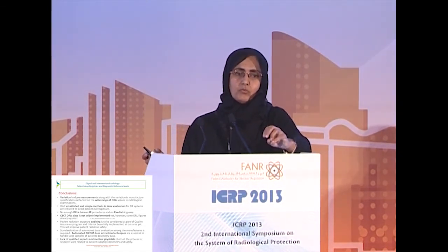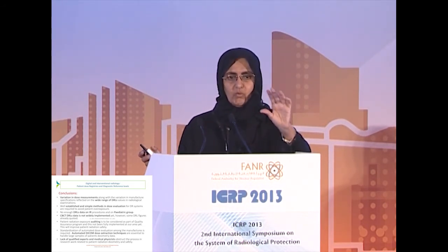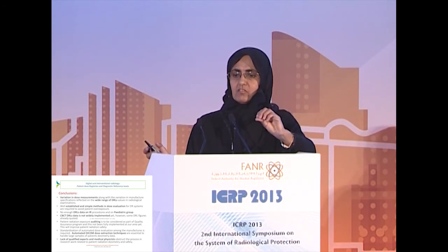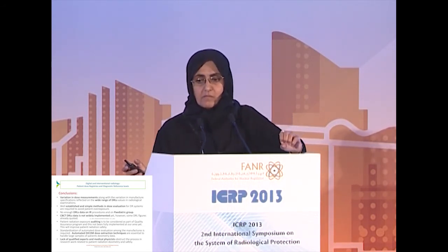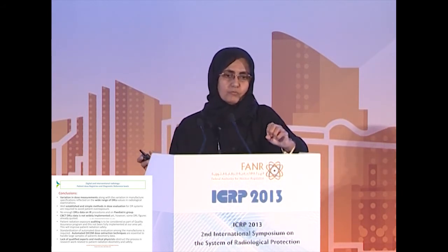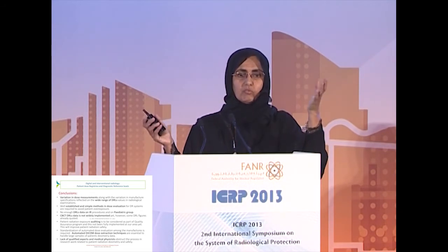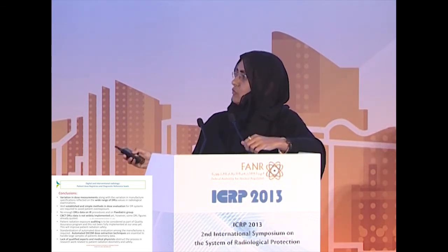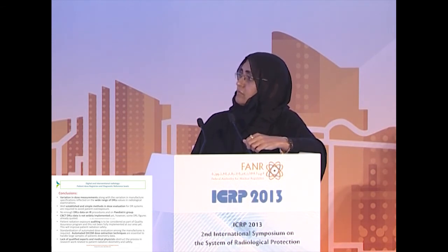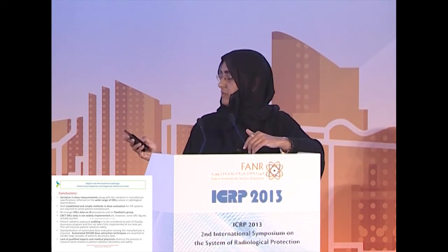Auditing is very important for us to implement. We have no well-established system for auditing, and an automated DICOM dose extraction technique is needed, especially as we are dealing with large, big data. And in our area, unfortunately, the lack of qualified medical physics experts limits our work in this.